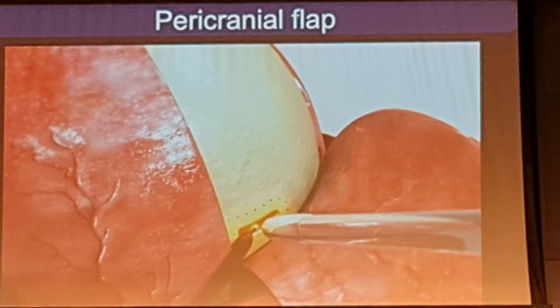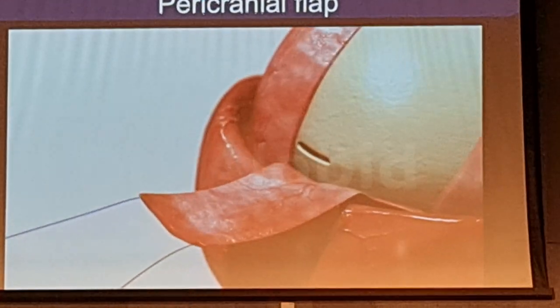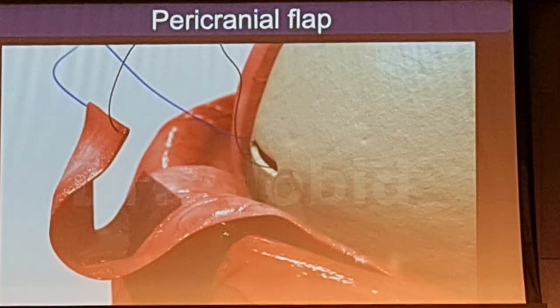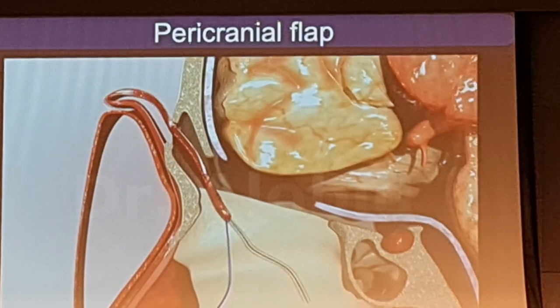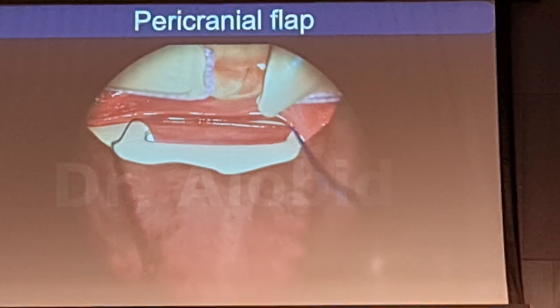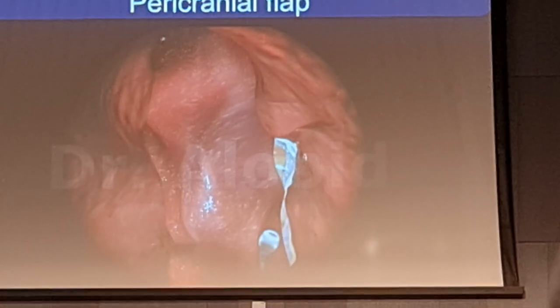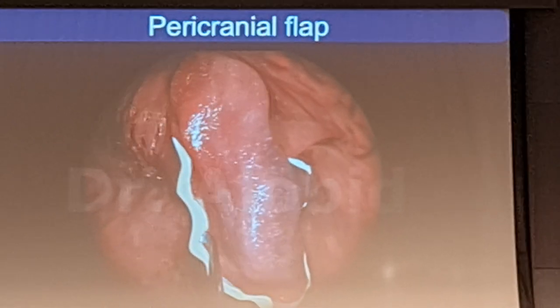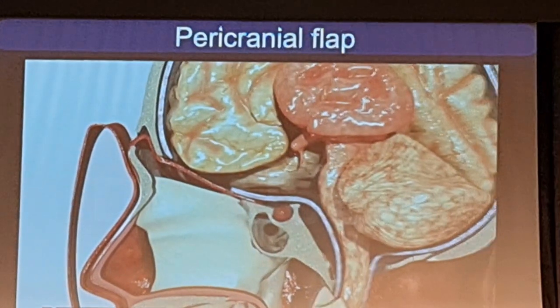I know where the frontal sinus is. I drill it. I do the osteotomy. I introduce the flap. It's very important. I mark both of them with black and blue to know where the right and left margins are. Otherwise, once it's in the nose, it's very, very hard to know where is left, where is right. So I pull both of them like a sheet, like this, and I put it underlay or onlay, depending on the place. So it works very well, you see.